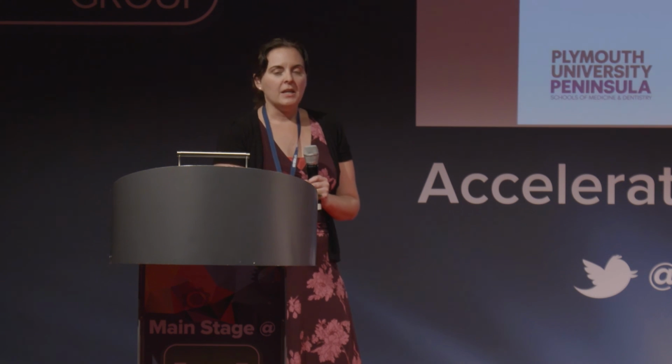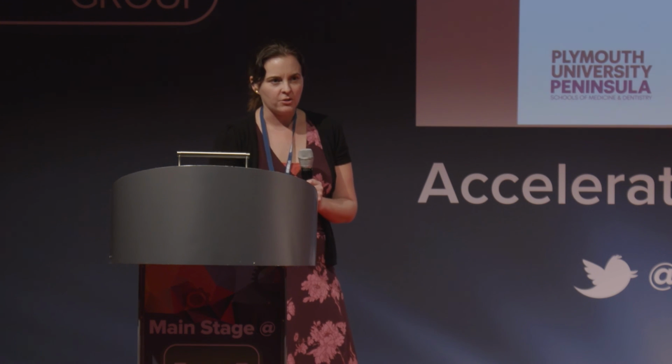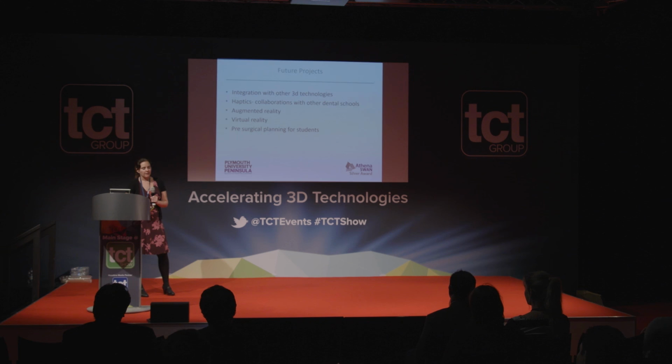And augmented reality in particular is quite useful. You can project the model of the tooth at the start, and then after they've drilled it, you can project the tooth from the start onto what they've drilled, and they can see what's changed. So it's quite good to see what they've taken away. And I think that both augmented and virtual reality, whilst they're in very early stages, they will get there, and they fit really well again with the 3D printing.